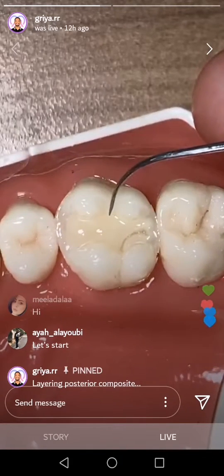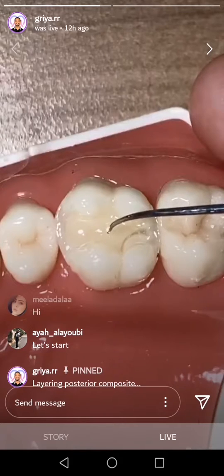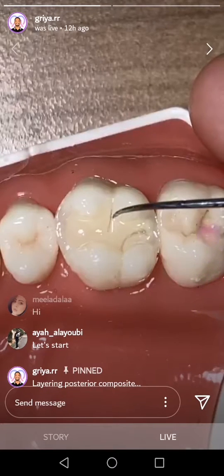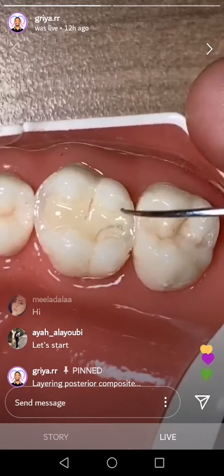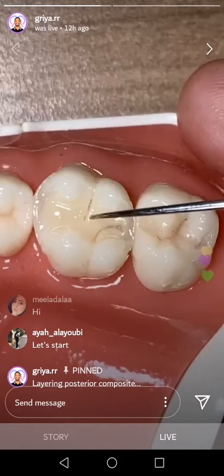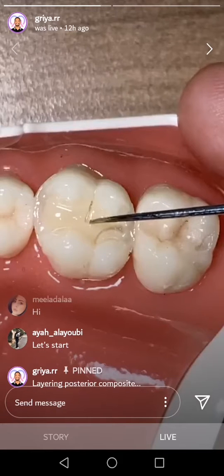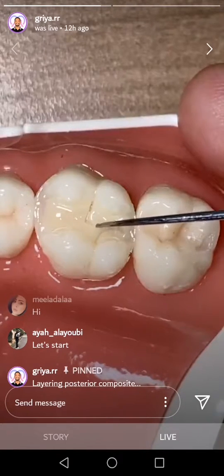So push like this, like this. Okay, and then I have a line in here. Yeah, you can stab slowly, yeah.